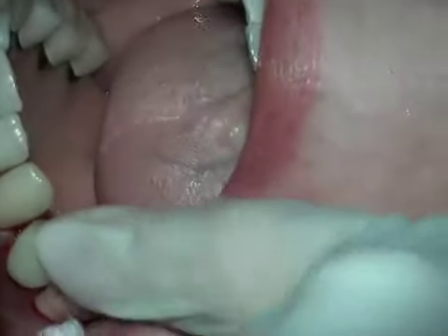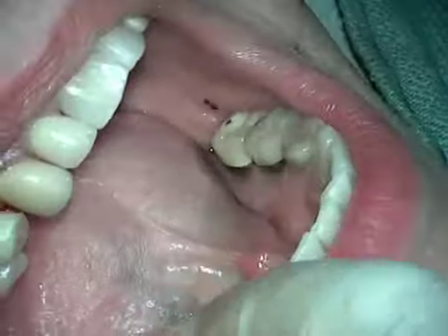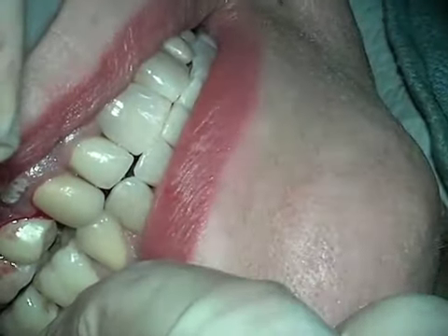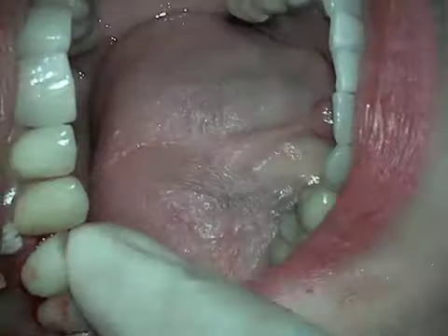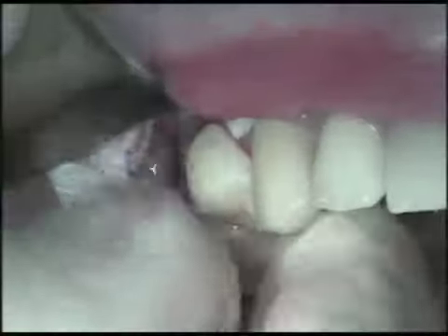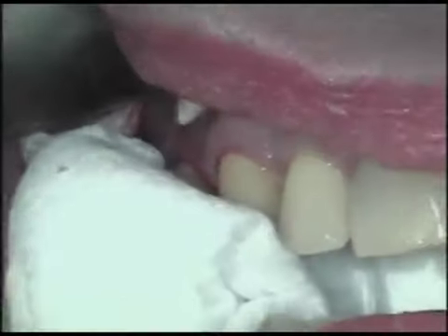So now let's go back and let's get our provisional crown. It's got a little bit of cement in it, just enough to hold it, not enough so that any extrudes out though, because it's really the retention of the coping that's going to hold this in place. And we press it down in place, and then make sure that it's fully seated, make sure that it's out of occlusion, and then of course have the patient bite down on a 2x2 gauze. Here we're verifying that it is completely out of occlusion. Looks good. You can see it's got very nice soft tissue contours, since we're going to have very nice soft tissue anatomy when this heals. And then have the patient bite down on the gauze, and we're done.